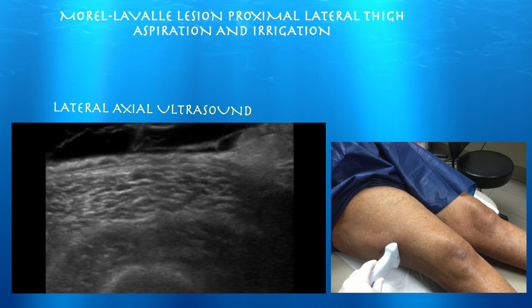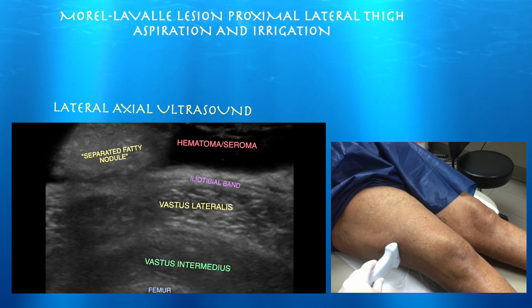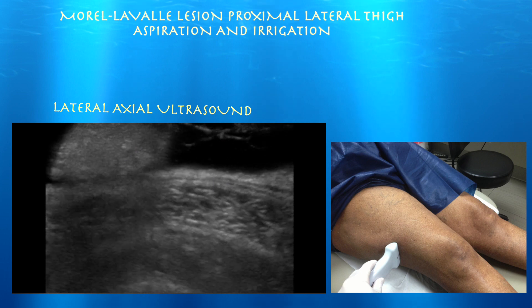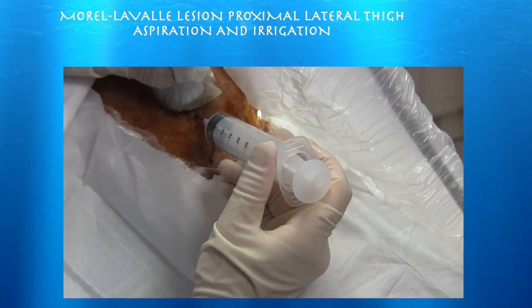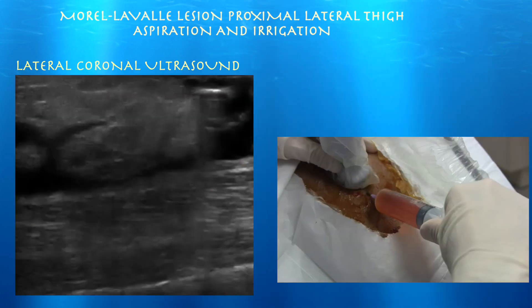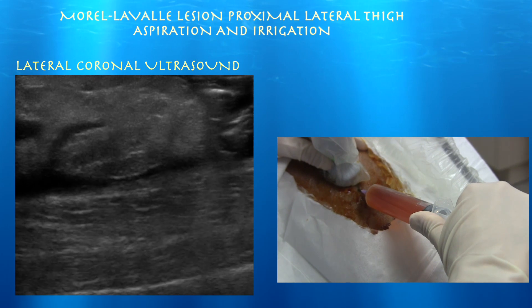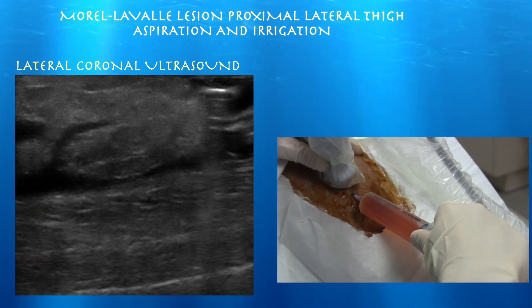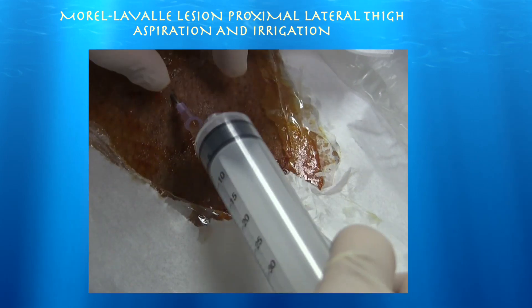Here we're looking at it in an axial view, and again we can see that separated fatty nodule. Looking at the fluid in a sterile glass — comparing it to how it was originally — it's a little bit lighter and not as bloody, because this is the second round.